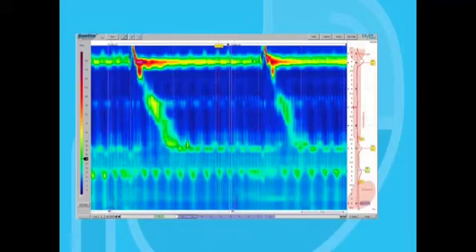And by the way, I also hope that you notice the hiatus hernia that's also visible in this tracing. If we apply the manometry metrics, the DCI comes out to 300 or less for each swallow, diagnostic of IEM. Incidentally, this is the most common motility disorder that we see in the GI motility lab.